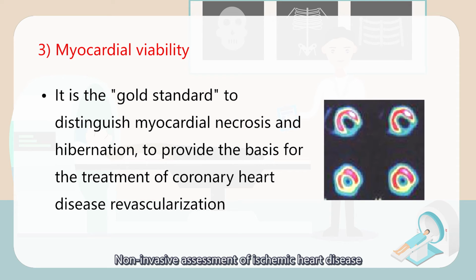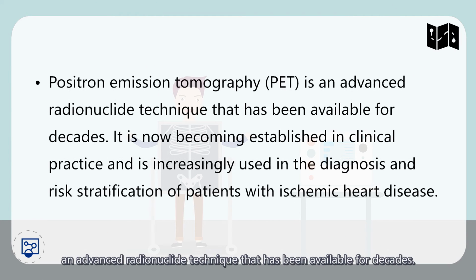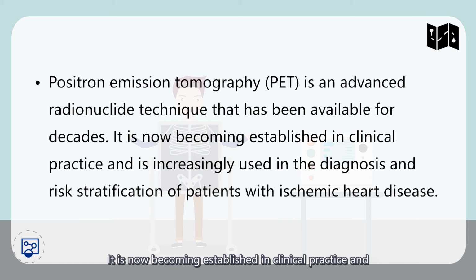Non-invasive assessment of ischemic heart disease remains a challenging task, even with a large armory of diagnostic modalities. PET is an advanced radionuclide technique. It has been available for decades. It is now becoming established in clinical practice and is increasingly used in diagnosis and risk stratification of patients with ischemic heart disease.